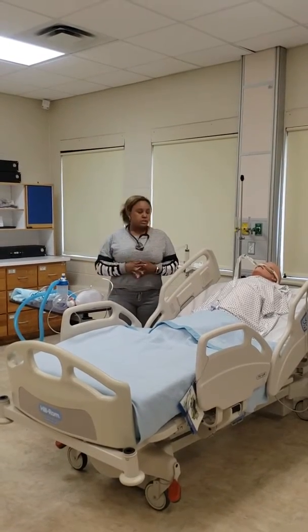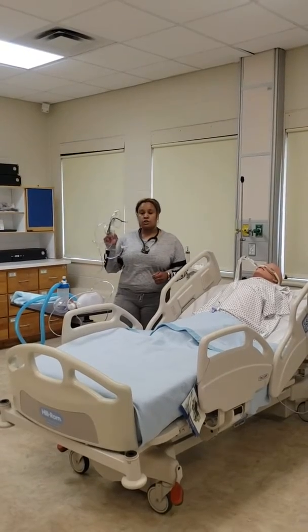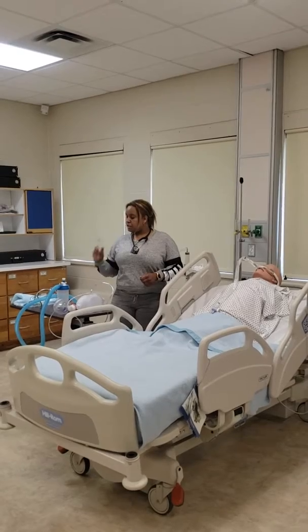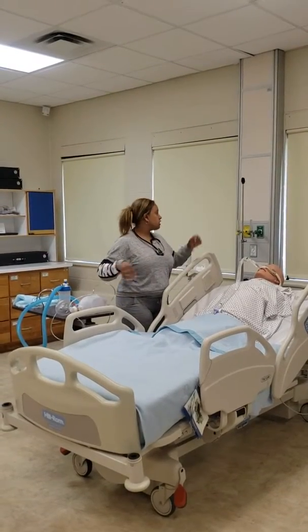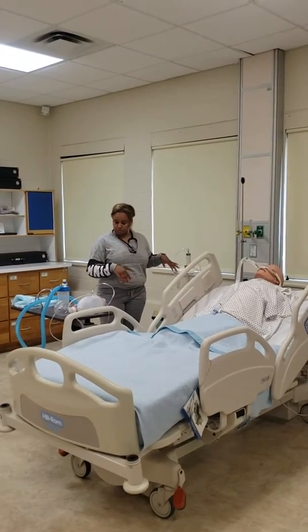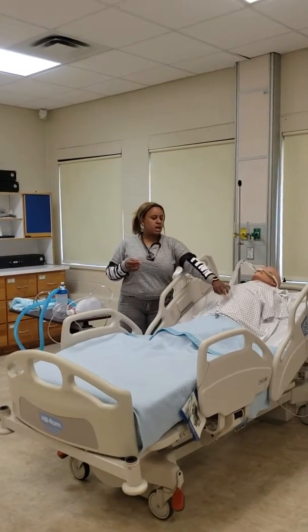I will now identify my necessary equipment. For extubation, it will be a chuck, small volume nebulizer, which is racemic epinephrine, a Yankauer, 10 milliliter syringe, gloves, manual resuscitator, my oxygen source, my suction source, my stethoscope, and my closed suction catheter.